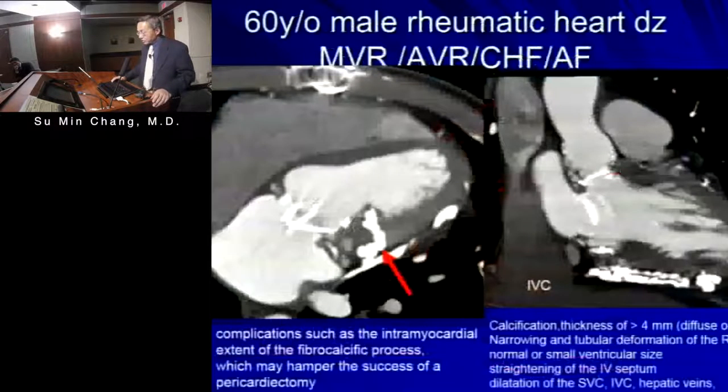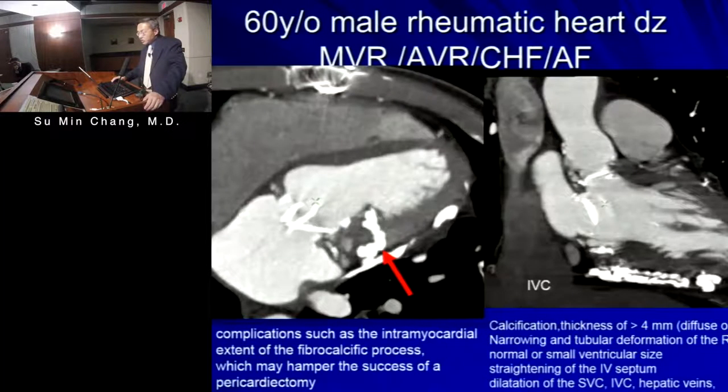And why is that important? Besides the diagnosis, I think it's very important for the surgeon to know the extent of the calcification before they go in, and specifically, as the arrow points, the intramyocardial involvement of calcification is extremely important because that could compromise the success of the surgery.